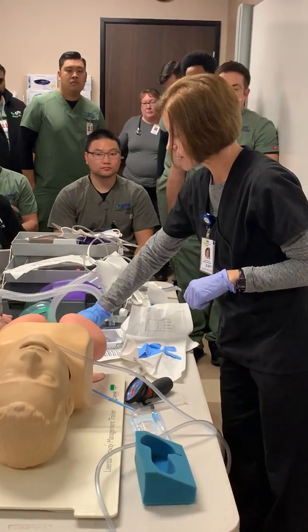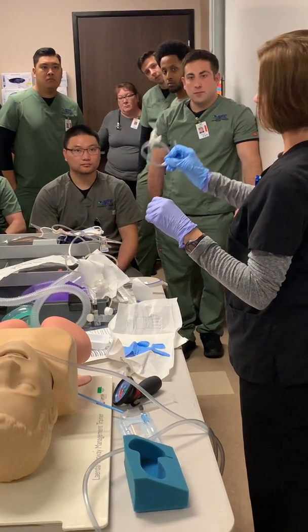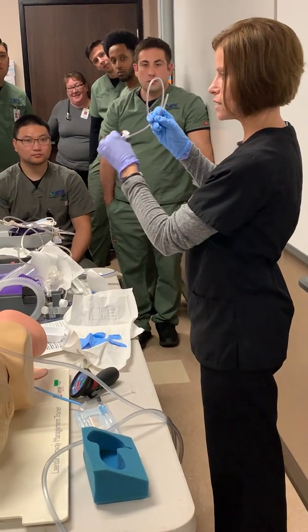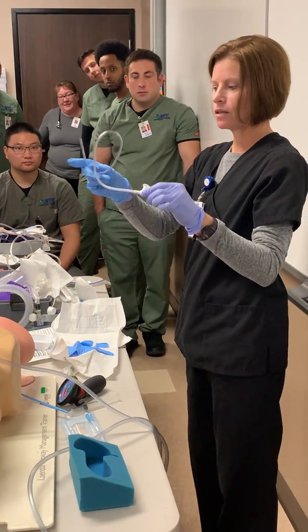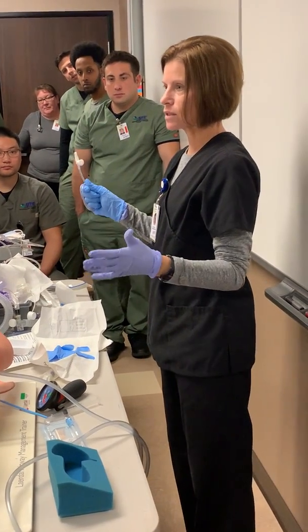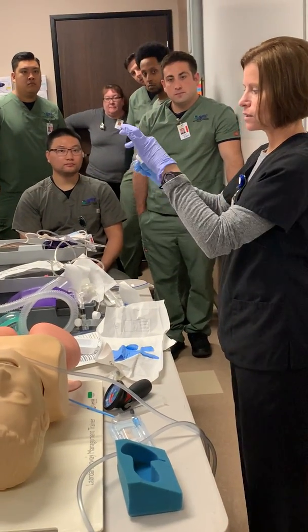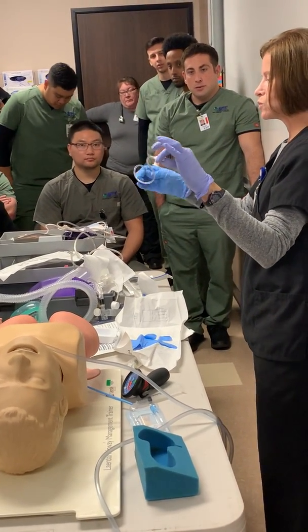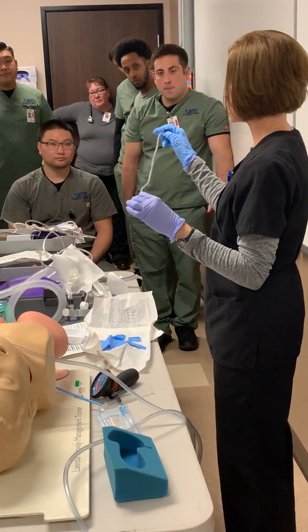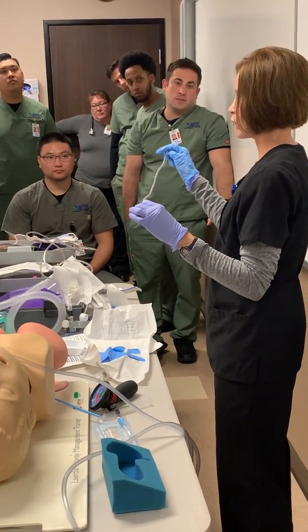I'm going to reach in and get the catheter, and I'm holding it right here. This white part is the thumb port. So I can hold on to this with what we'll call my dirty hand. And what you want to do is wrap this around your hand, because once again, if my phone or something crazy goes on, this is still sterile, right? This part I can touch. Sometimes when you take this out of the package, it's going to be kind of stiff. So what I've gotten into the habit of is manipulating it just a little bit to warm it up and get it more flexible.